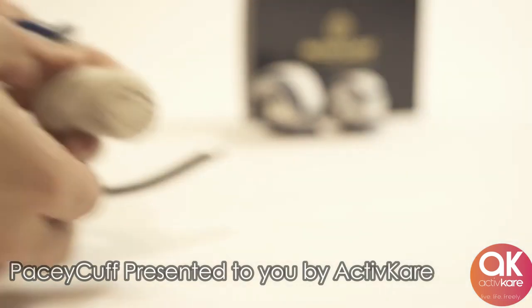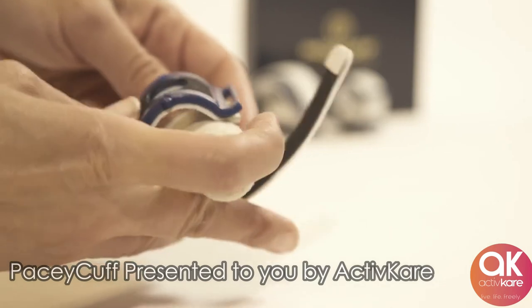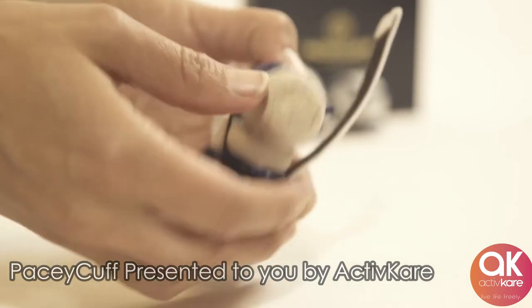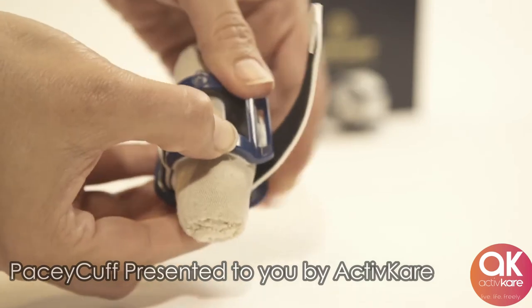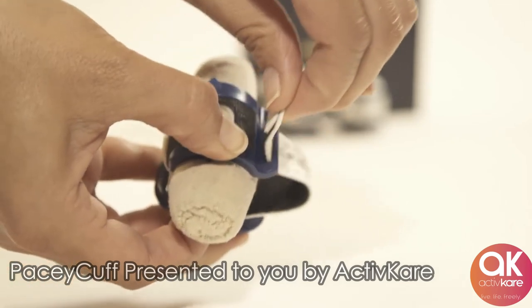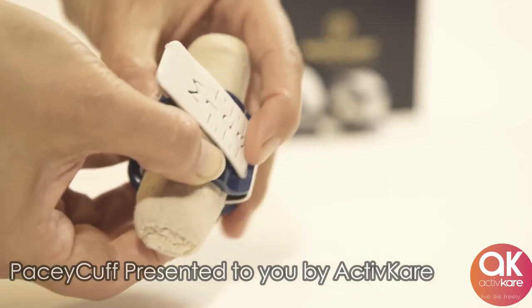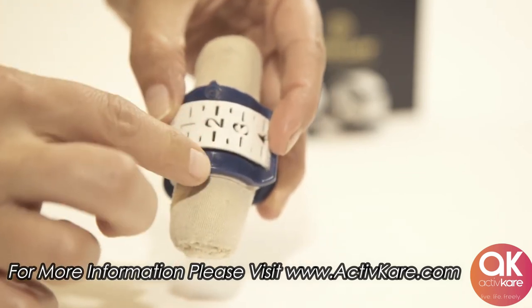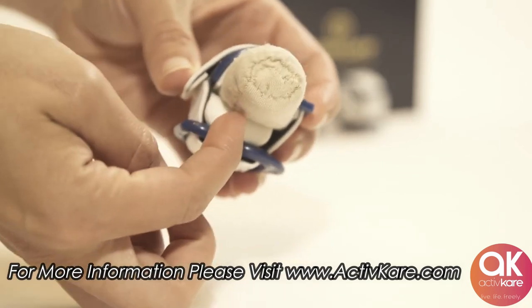This is how to wear the Pacey Cuff. First, wrap the Pacey Cuff around the penis, with the bottom compression pad on the bottom of the penis and the top fenestrated hood on the top side of the penis. Then compress the Pacey Cuff to the appropriate tension needed to stop leaking. Finally, secure it in place by pressing the adjustable Velcro strap down over the top.